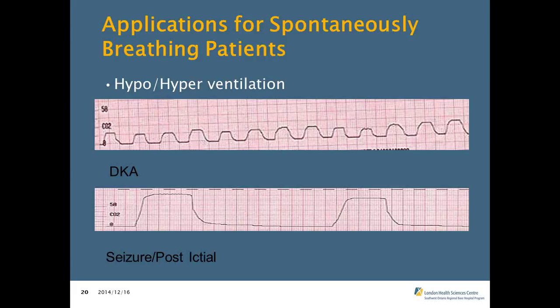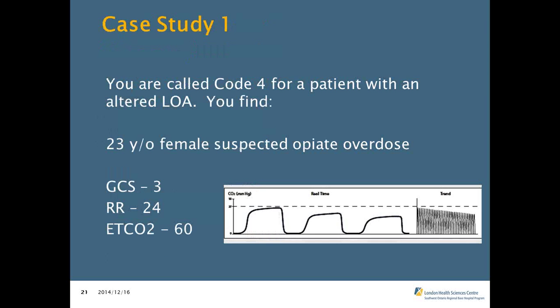Absolutely. So just based on the history alone, the patient's had a seizure. After you get there, seizures subside, and your post-ictal patients tend to hypoventilate just from the process itself, and you look at the patient and you're not seeing that chest rising and falling like it should. You hook up your capnography and sure enough it shows exactly what you already know is going on with this patient. So just a piece of the puzzle.